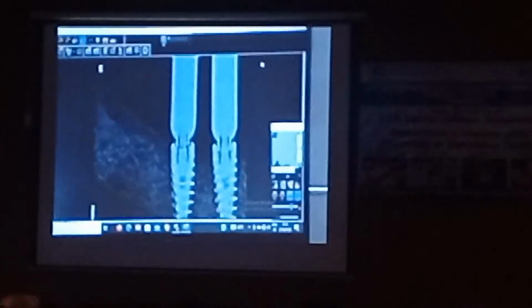See, this is a good thing that we know now that they are not seated. Can you see that? Show them. Can you see that they are not seated?